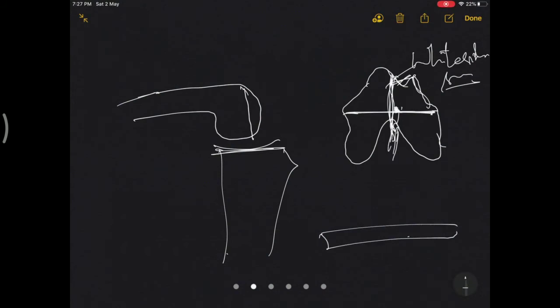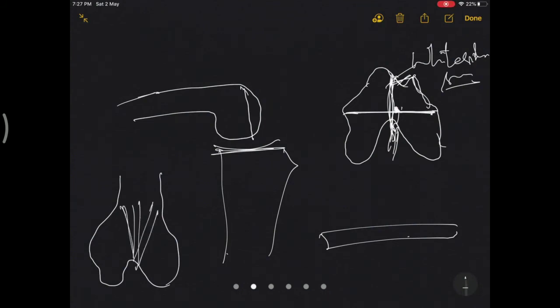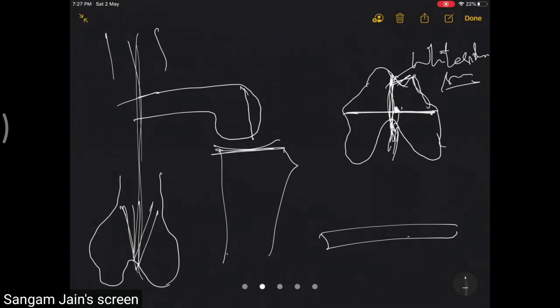isthmus, because you don't want any toggling, because the distal femur is somewhat broadened like this. If you have a short one, it can toggle around and your cuts are affected. So you have a really long intramedullary jig which almost goes to the isthmus and fits snugly. By doing this, you have aligned your intramedullary jig to the anatomical axis of the femur.